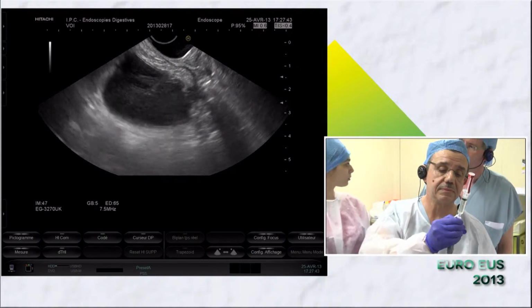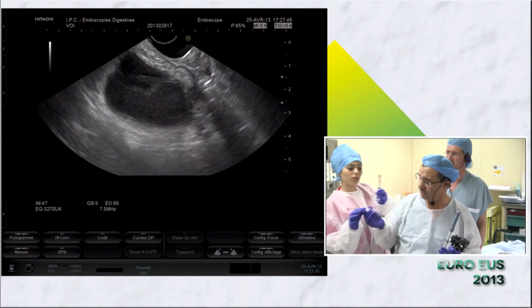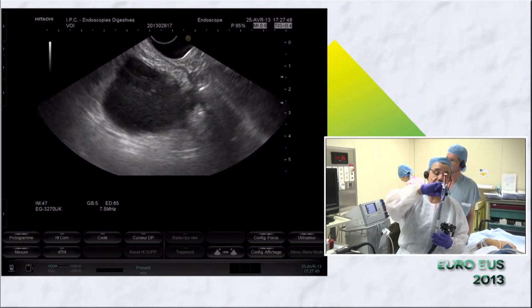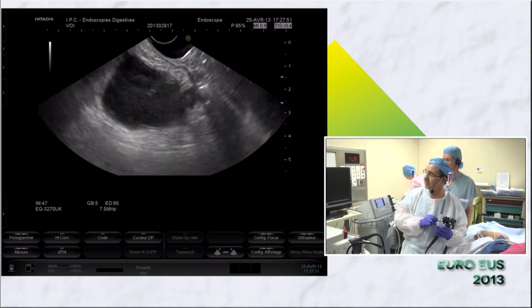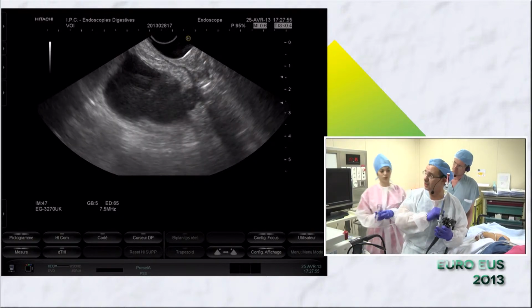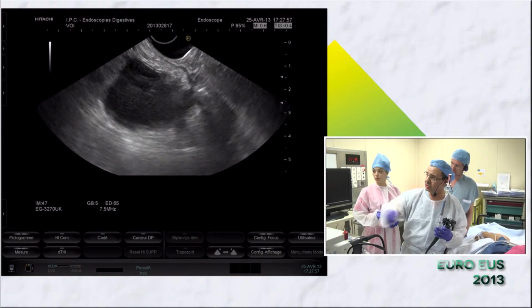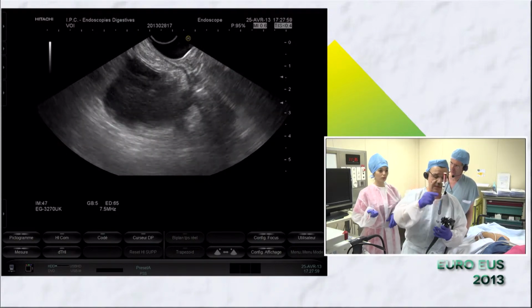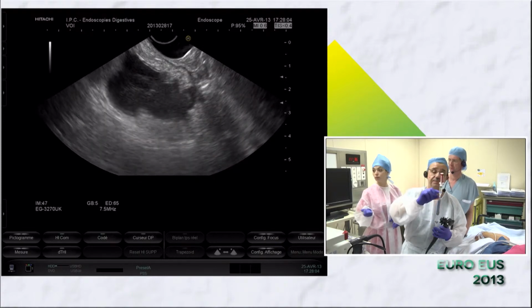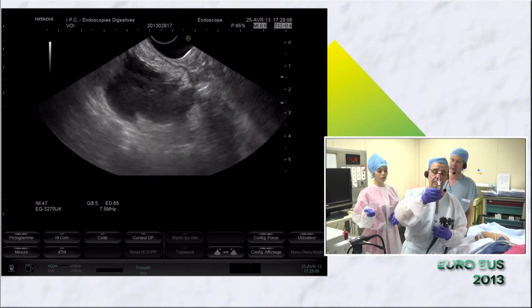But in such a case, you should only puncture the cyst once to avoid creating too many holes and to avoid backflow of alcohol outside of the cyst. This is a very important point. And also not to cross the cyst with the needle; sometimes I use the brake on the needle. You have to be very careful doing this.